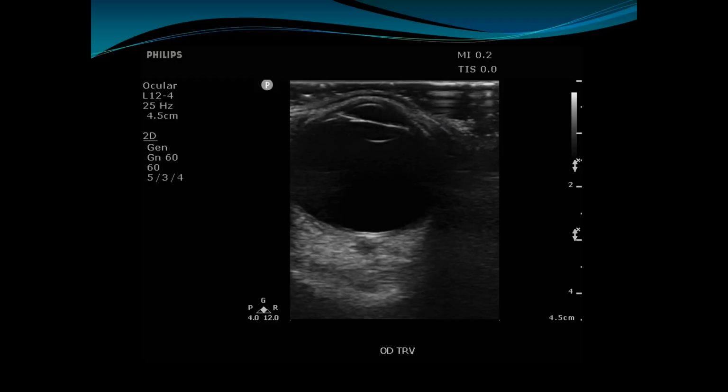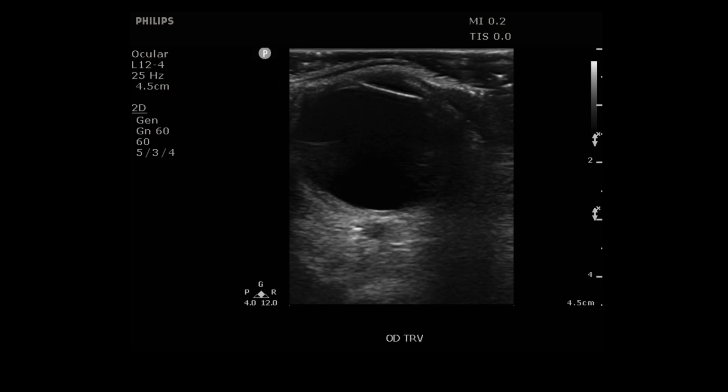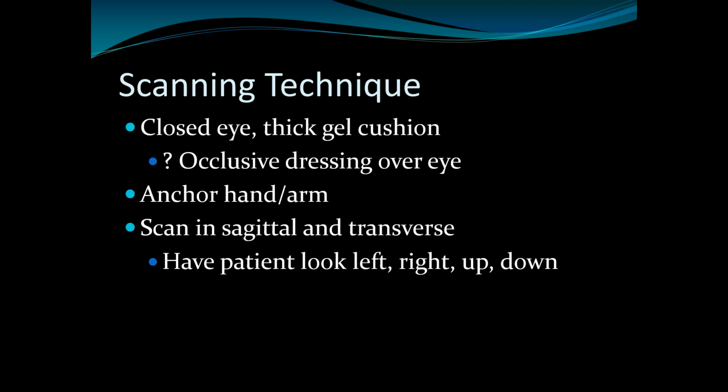So when you're scanning, you're going to have the patient look to the left and the right. We'll go into the anatomy in a minute. And also you're going to have them look up and down in both of these views to help you see the entire vitreous. You can also watch the pupillary reaction. So if you put the transducer at the side of the eye, lateral to the eye, or even inferior to the eye, and again, you need a lot of gel, you can actually see the pupil. You can see the iris and the pupil really well, and you can see the pupil constrict. So basically, closed eye, thick gel cushion, anchor the arm, and then scan in sagittal and transverse with the patient looking up, down, left, and right.